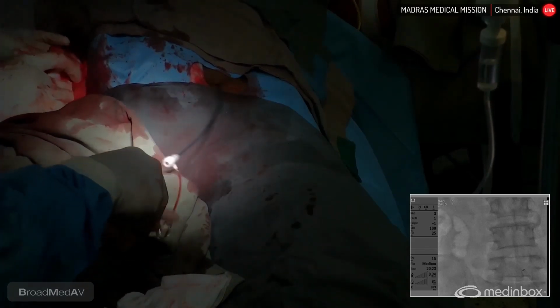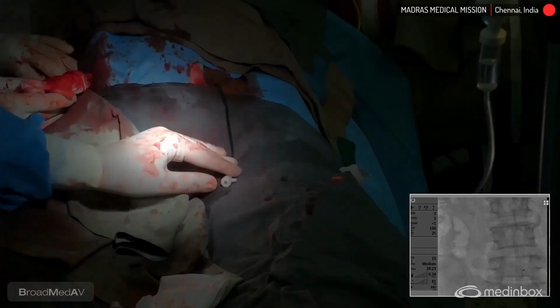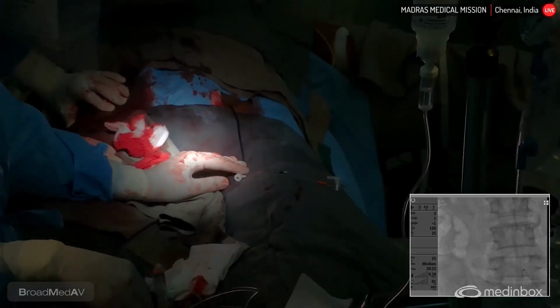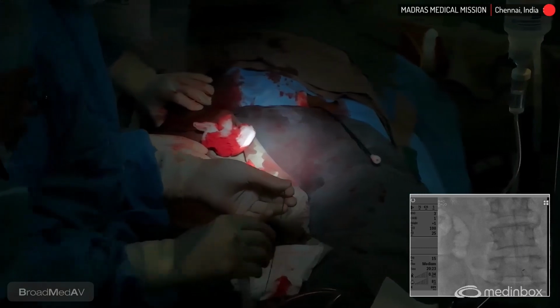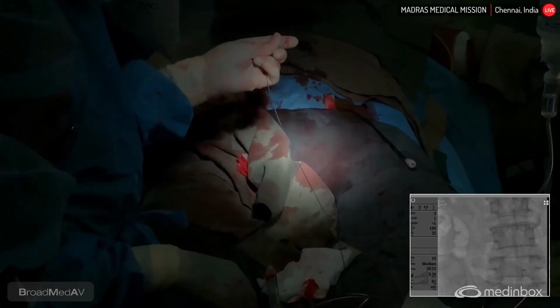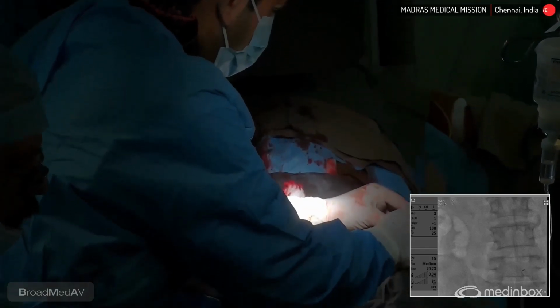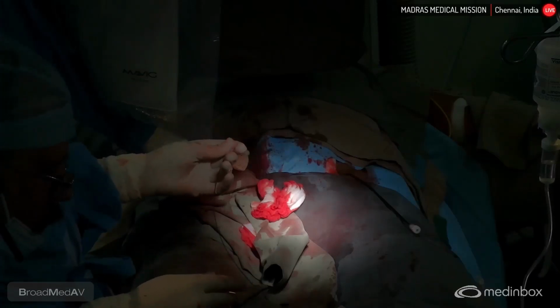So what we are going to do is put our contralateral sheath, then take a 10 balloon and occlude the right common femoral artery for a dry closure, and then we'll try to close the access. Do we have a cover stent? What cover stent are we having?